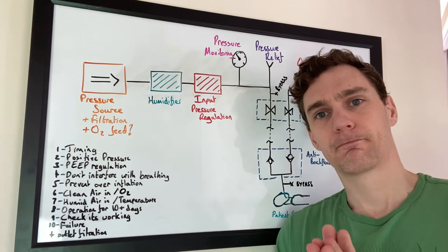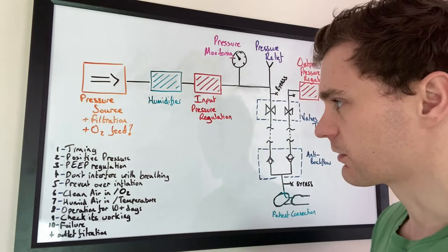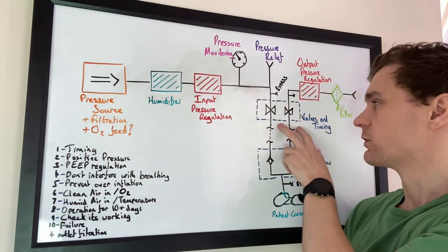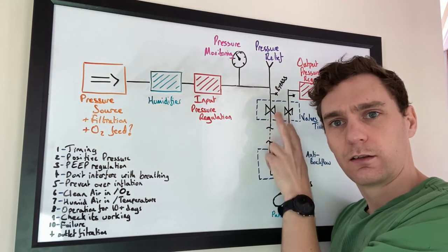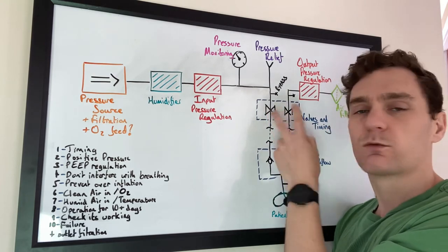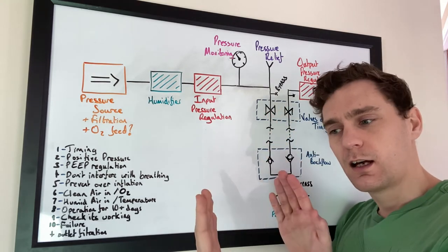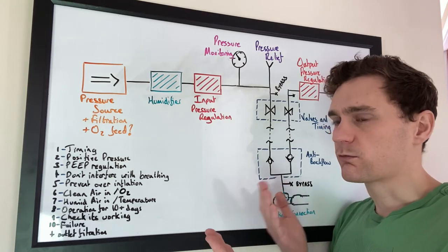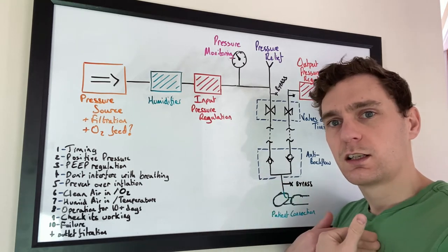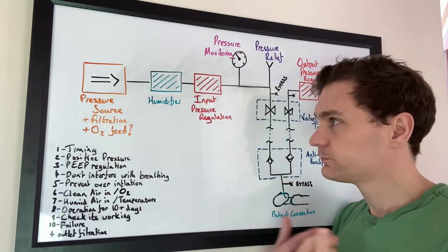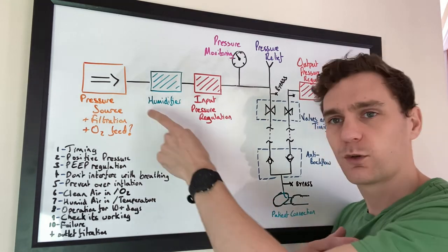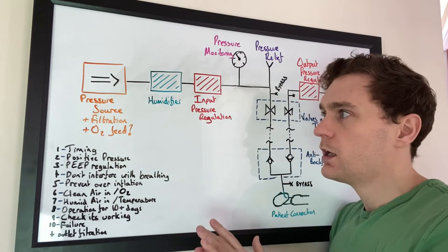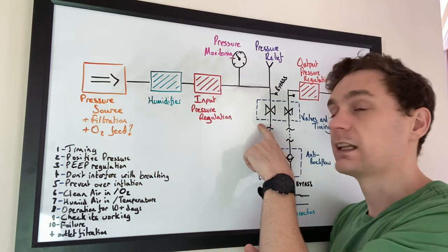So let's go down the list of ten things and see how many of those we've covered. First, timing. Okay, yep, we've got these valves here. They do the timing of the breath. If you change the rate at which they switch and how long each one is open, then you can change the breathing rate and you can change the ratio of inspiratory to expiratory phases, breathing in to breathing out. If your pressure source is cyclic, if your pressure source is like bellows, that pressure source has to be linked to these valves.